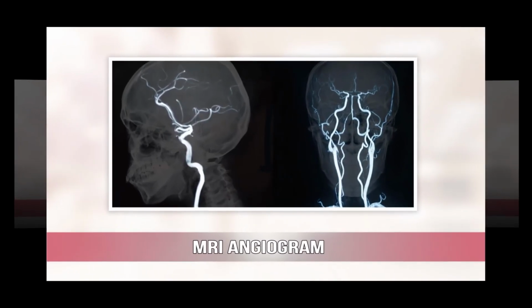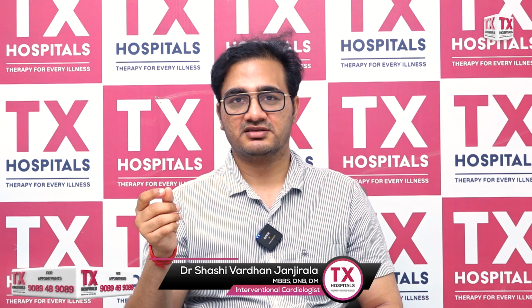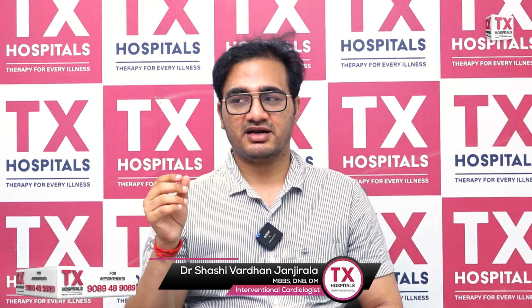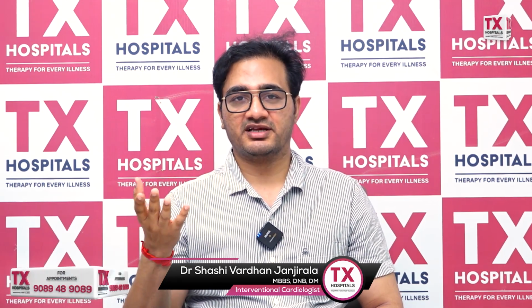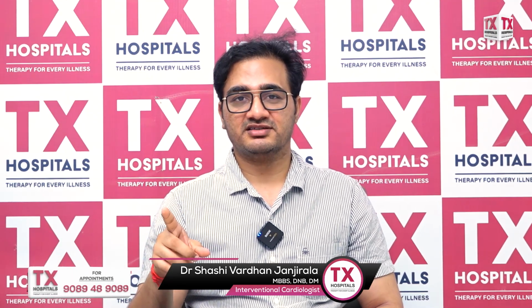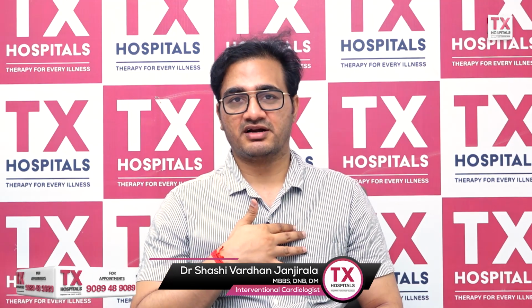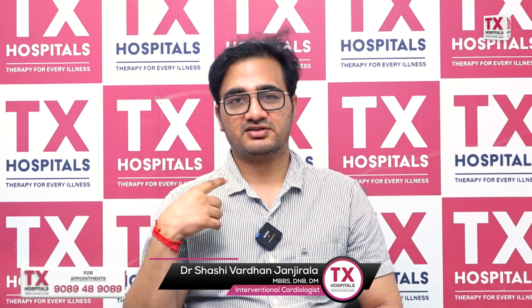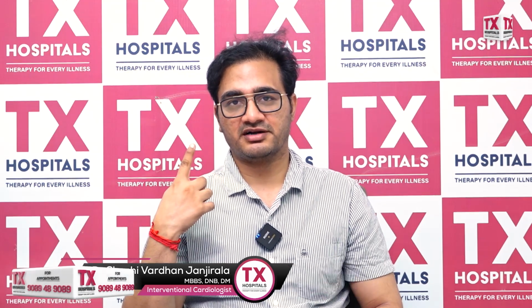Most of these patients present to neurologists or general physicians, who advise MRI and MR angiogram, where we can see the internal carotid artery blockage. We put a stent across this internal carotid artery and open it up so that there won't be any future episodes like that. So one indication is a stent in the coronary arteries, which take blood to the heart, and the other is the carotid artery.